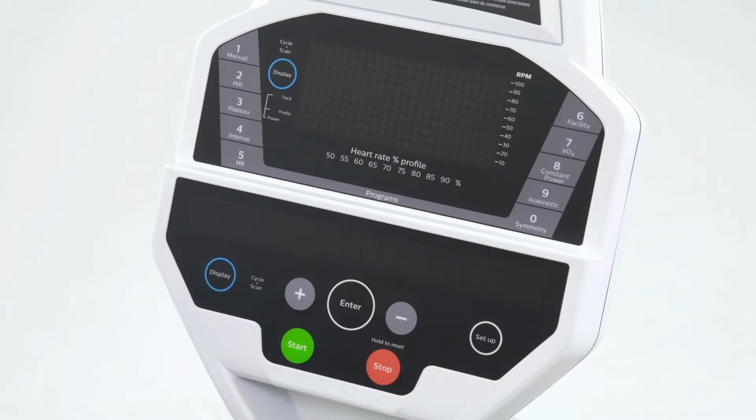We have a VO2 Test. It's the YMCA protocol submax VO2 test. A facility program allows you to build your own protocols and profiles and save them there. And then on the left side, we have a few exercise programs, a hill, a plateau and interval, and then a heart rate control program. So that is the basic functions for the bike from the console standpoint.